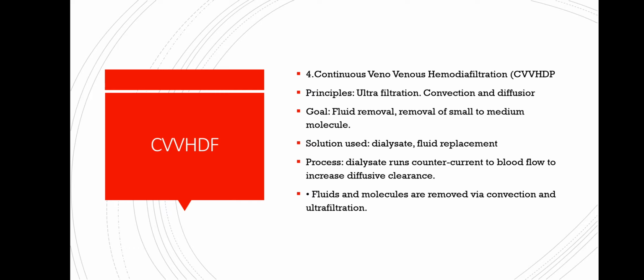Solutions used in CVVHDF are dialysate and replacement fluid. In this process, the dialysate runs counter current to the blood flow, which increases diffusive clearance. Fluids and molecules are removed by convection and ultrafiltration.